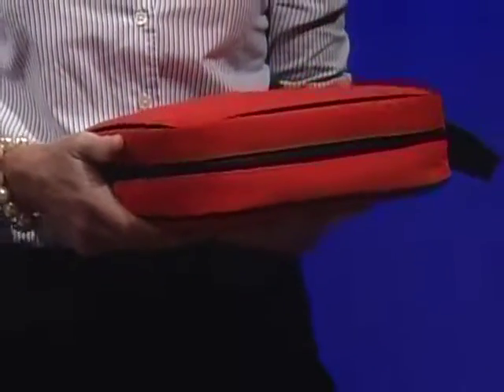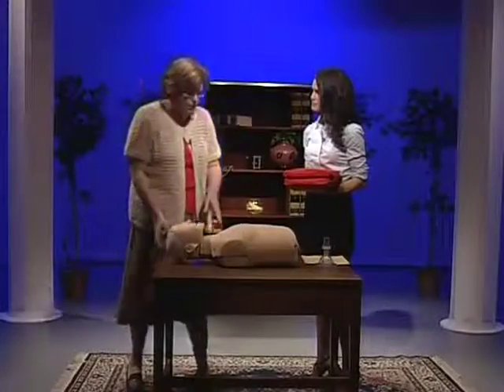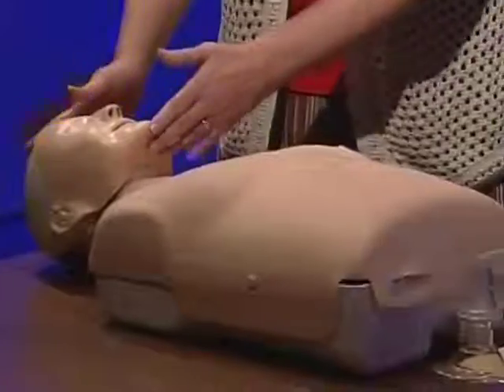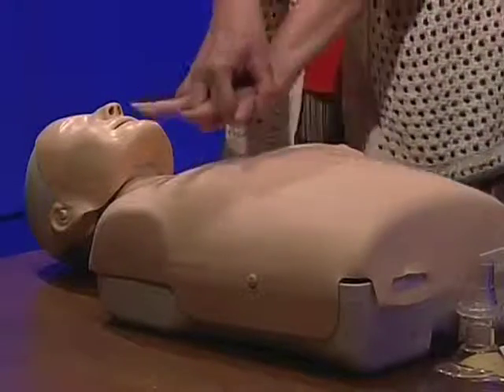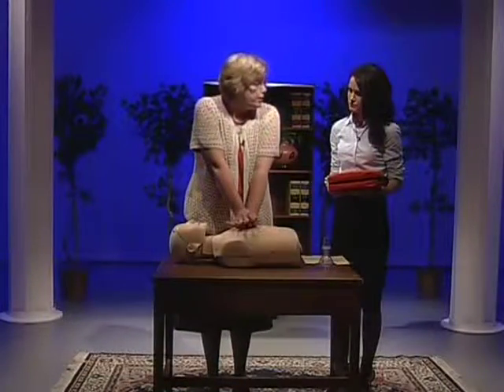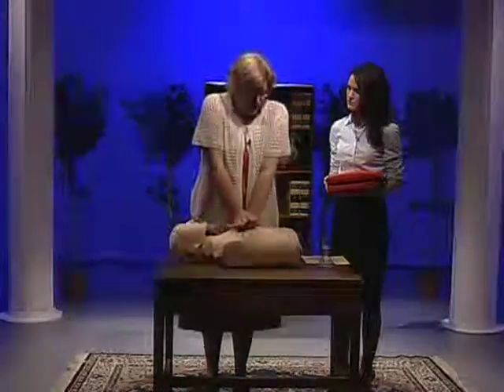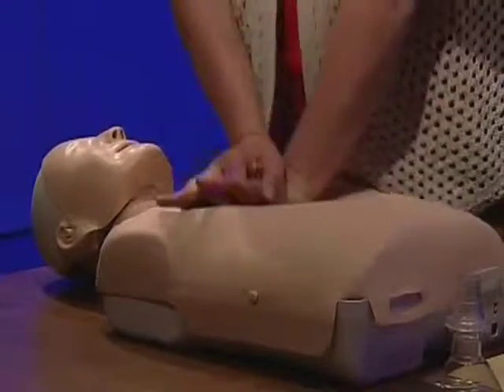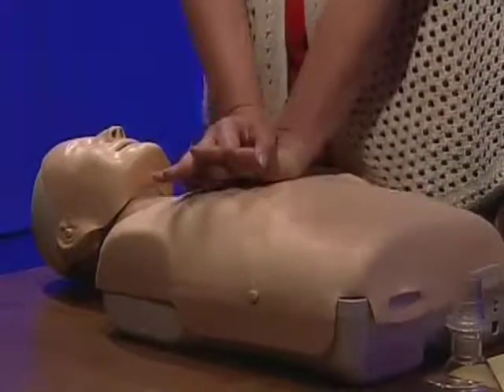All right. So I have found this victim. Annie has collapsed. So I'm going to shake her. Annie, wake up, wake up. There's no signs of life. There's no movement or anything. I'm going to immediately go to the center of her chest. I'm going to stiffen my arms, and I'm going to push down 2 inches. I want at least 2 inches, and I'm going to do that 30 times. And you're on the way to bring me that AED and call 911.